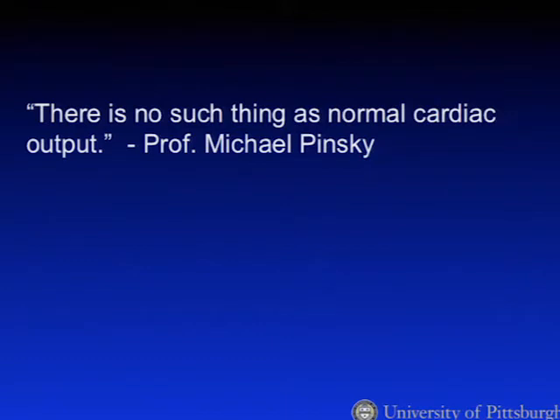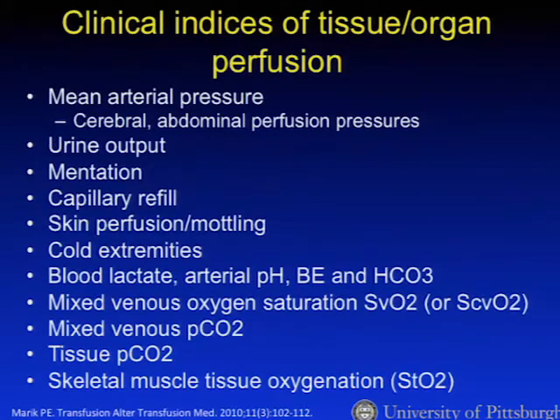The last point with respect to cardiac output monitoring, again, to quote one of my favorite professors: there is no such thing as a normal cardiac output. There is only adequate and inadequate. And so it's important to take these numbers into view given their clinical context. There are numerous methods of assessing the adequacy of end organ perfusion. We'll only discuss mixed venous oxygen saturation.